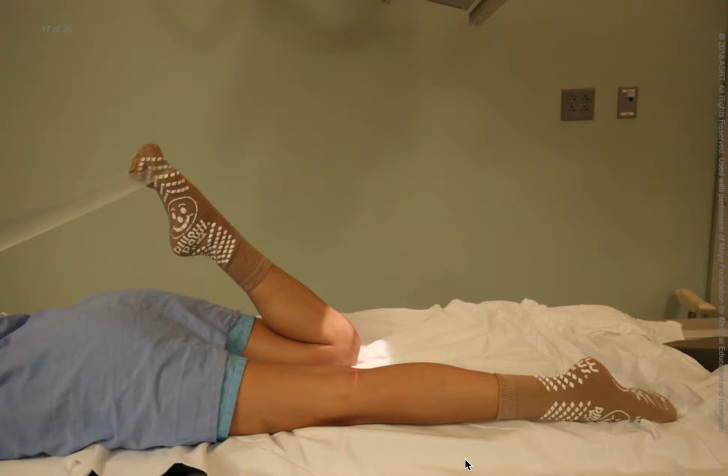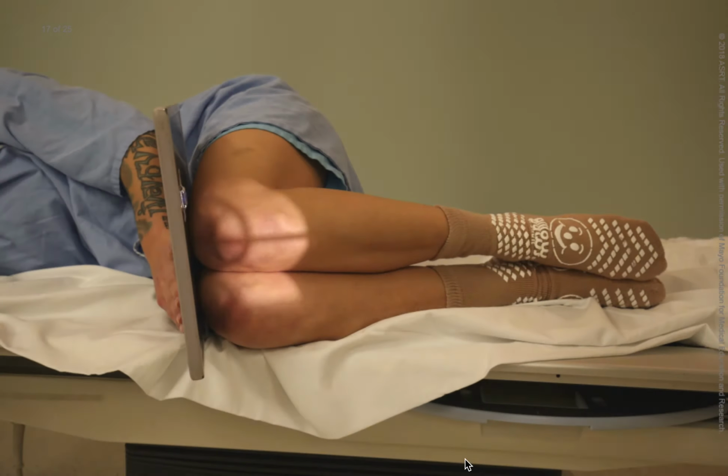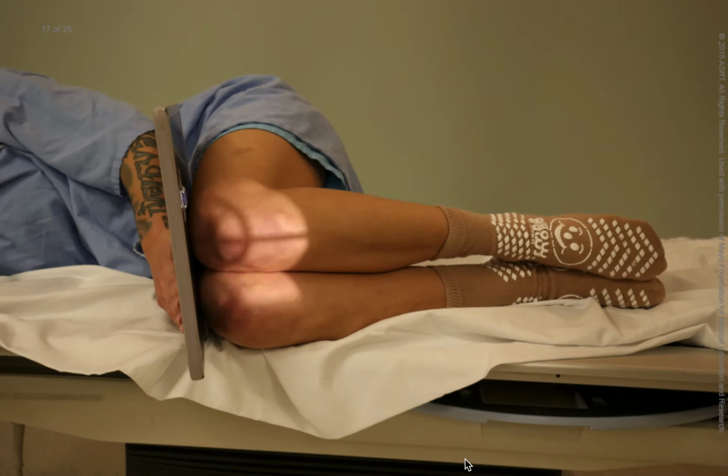Position the image receptor under the knee and center it to the patellofemoral joint. If the patient is in a lateral recumbent or seated position, make sure they are able to hold the image receptor firmly in place and that the correct OID and SID relationships are maintained.